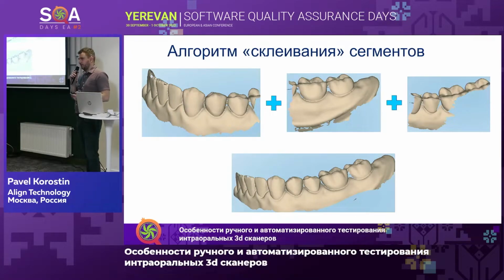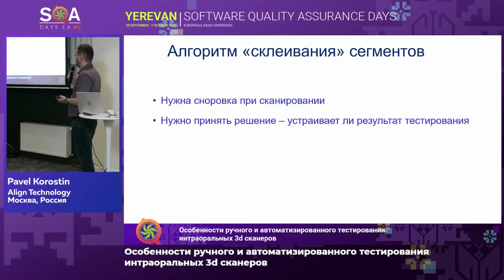And this way, by this experience, we can and should collect the full spectrum of cases, which will be covered by the preparation of this test data. We will find all the values of the overlaps, small and big, and all of this should be done manually. And it's quite easy to make a mistake here. The more scans you do, the better. If you make a mistake, then you have to discard it.